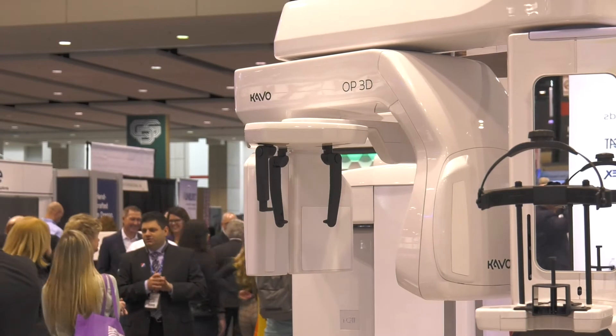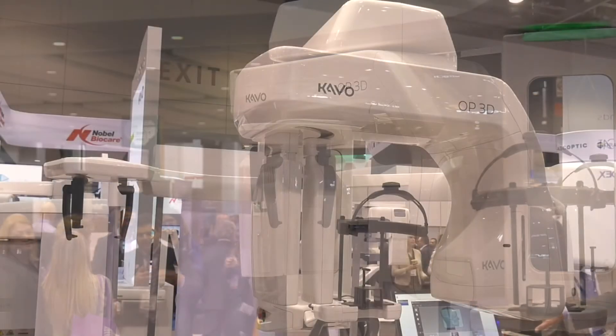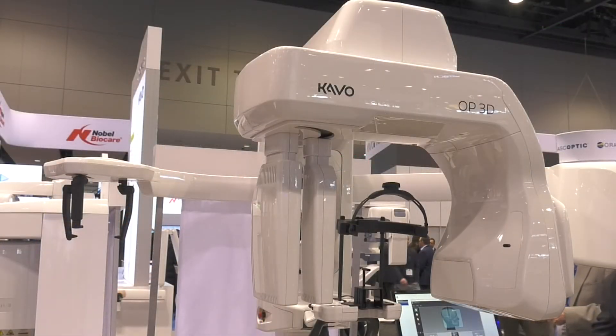And once it's ready, it'll say ready down here in the corner, and then you just go ahead and hit the exposure button. That's pretty slick. For those who are not at the Chicago Midwinter Show this year, where can they find more information? Just go to Kavo.com. It's also available through Henry Schein, so get with your local Henry Schein representative and they can set up a demo for you. Well, thank you guys. Thank you.